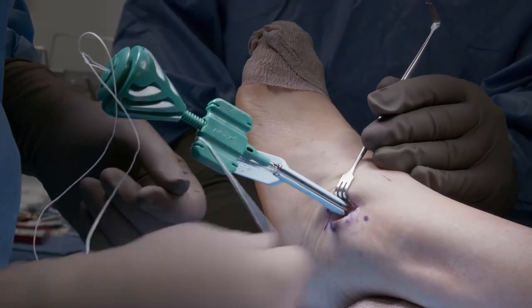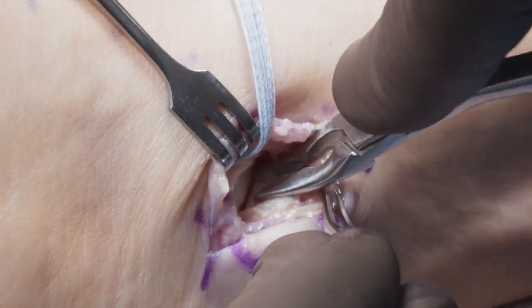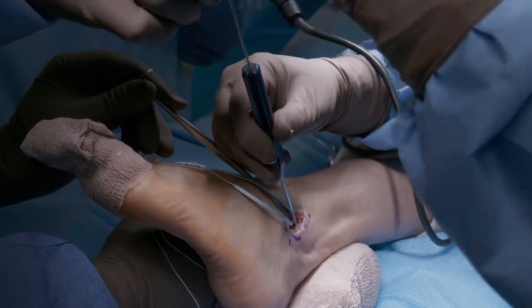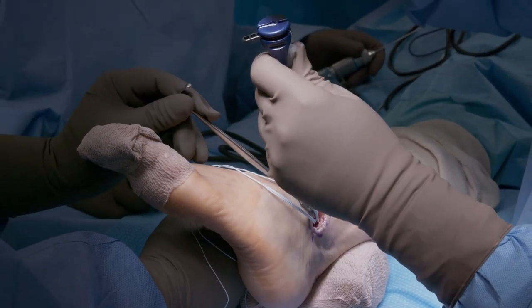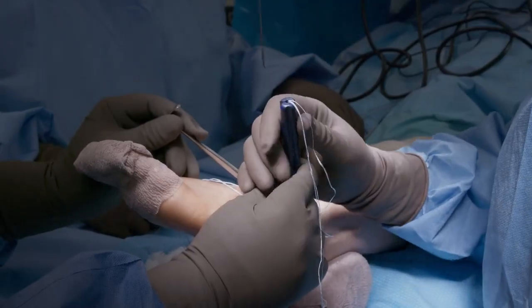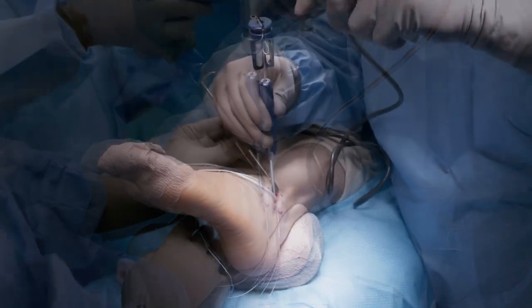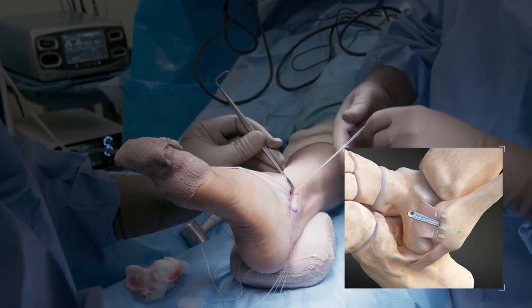Place the fiber tape to the side and move your attention to preparing the fibula. Prep the fibula for the DX knotless fiber tack anchors for a primary repair of the ATFL. Drill 1 cm from the distal tip of the fibula with a 1.8 mm K-wire. Implant the DX knotless fiber tack anchor with gentle malleting until the driver is flush with the slotted drill guide. Do not advance the guide any further with the mallet as it could compromise the cortex. Unload the anchor driver and drill. Do not set the anchor. Repeat the steps for the second DX knotless fiber tack anchor 1 to 1.5 cm above and anterior to the first DX knotless fiber tack anchor.